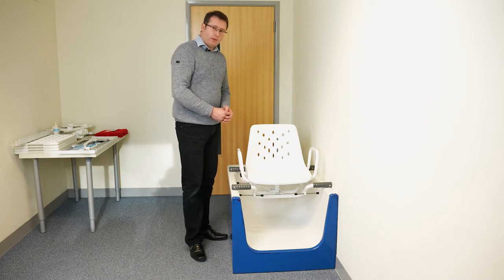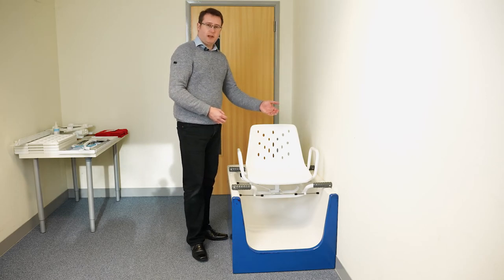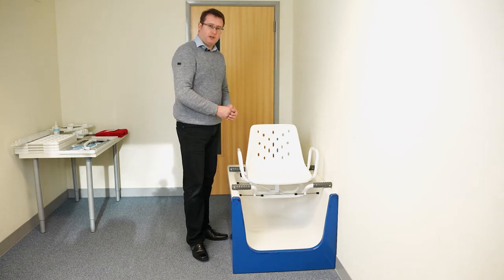The Ultra Swivel Bather has a locking lever that comes on the right-hand side out of the box, but it can also be easily changed to the left-hand side. The swivel bather locks at each of the 90-degree positions.